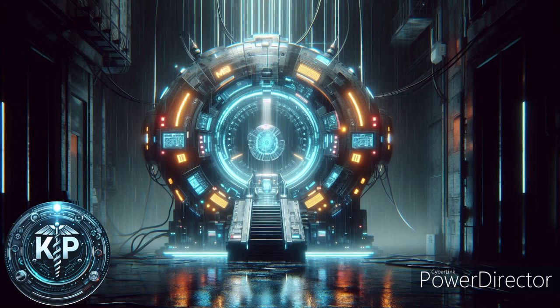Magnet, the most critical component of an MRI system. The magnet creates a strong and stable magnetic field necessary for the imaging process. This field aligns the protons in the body, which are then manipulated by other components of the MRI to produce an image. Gradient coils. These coils are used to apply a variable magnetic field across the patient's body. By changing the magnetic field strength at different locations, the gradient coils help spatially encode the positions of the protons, which is crucial for creating a three-dimensional image.